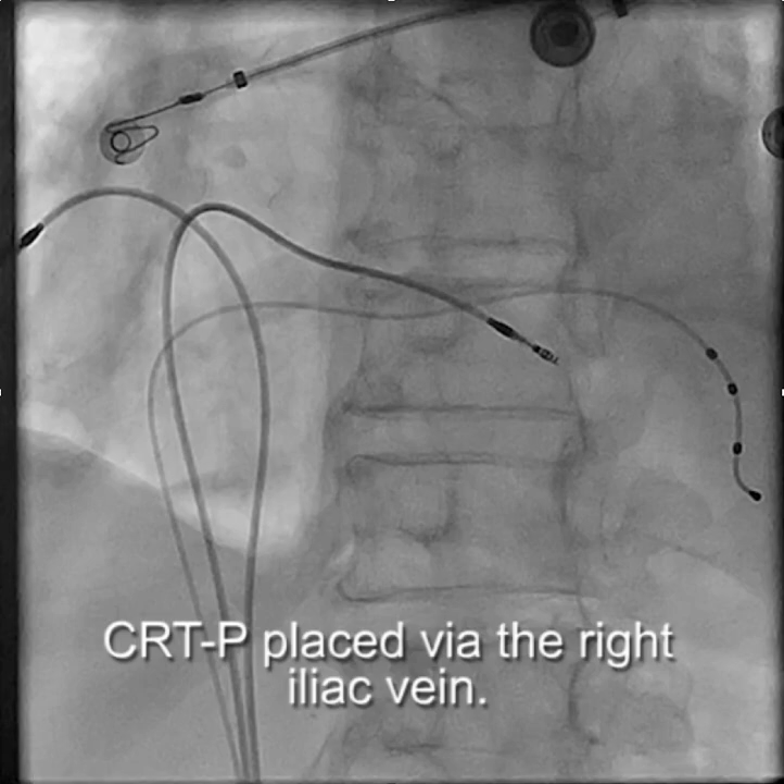This video describes how a CRTP pacemaker can be implanted using the right iliac vein in a patient with no other options. You can see here we have the LV lead, the RV lead, and the right atrial lead.